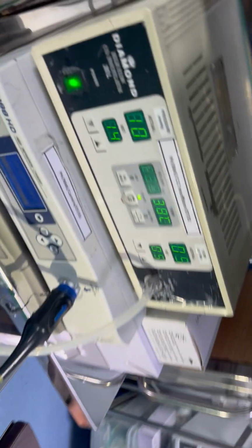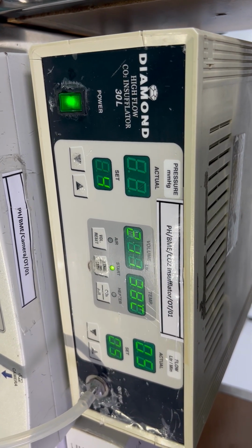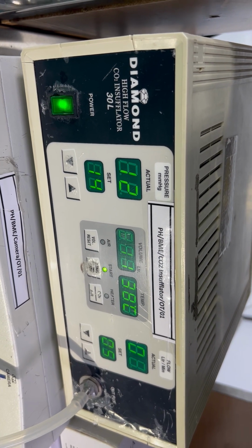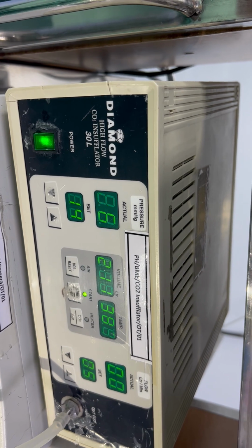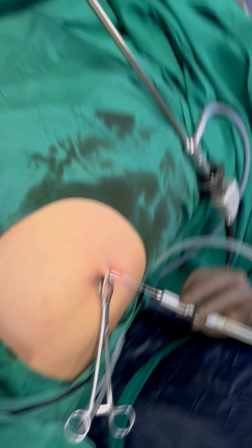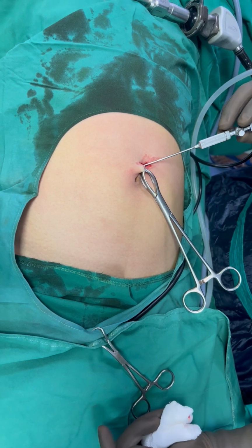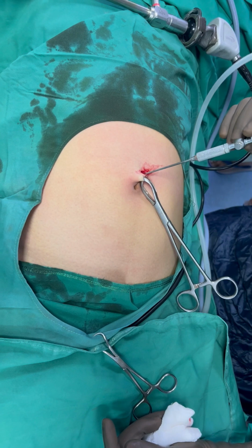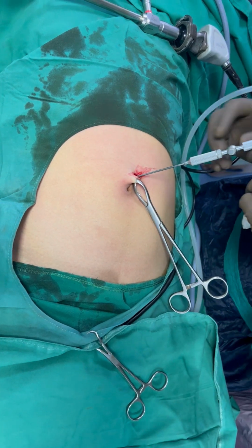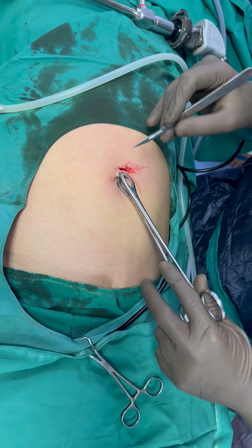This is the CO2 insufflator machine. Set flow rate is 5 and set pressure is 14. Once this set pressure matches with the actual pressure, we will remove this Veress needle and we will insert a trocar. Now the pressure is 14, so our pressure is matching with the set pressure.